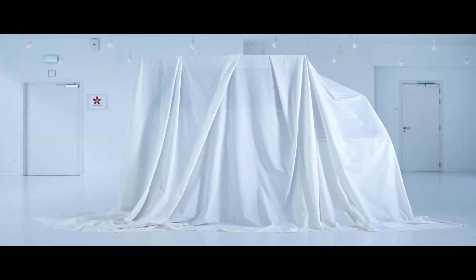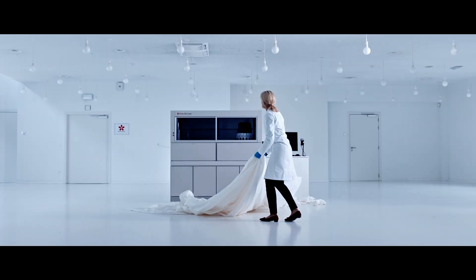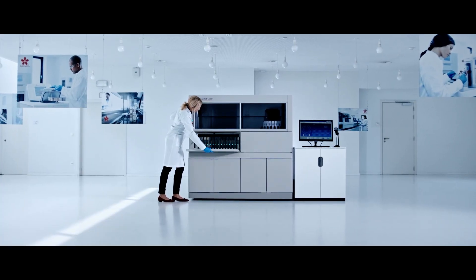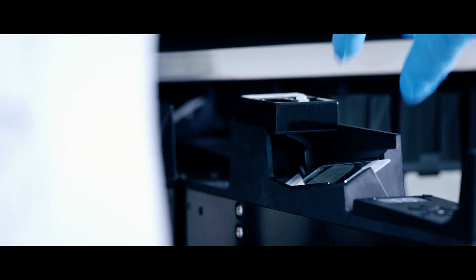Begin working smarter today to better impact patient outcomes tomorrow. Welcome to the TissueTech Genie Advanced Staining System from Sakura Fine Tech. With its 30 fully independent staining stations, the Genie offers true random access and will not slow down when you add more slides.